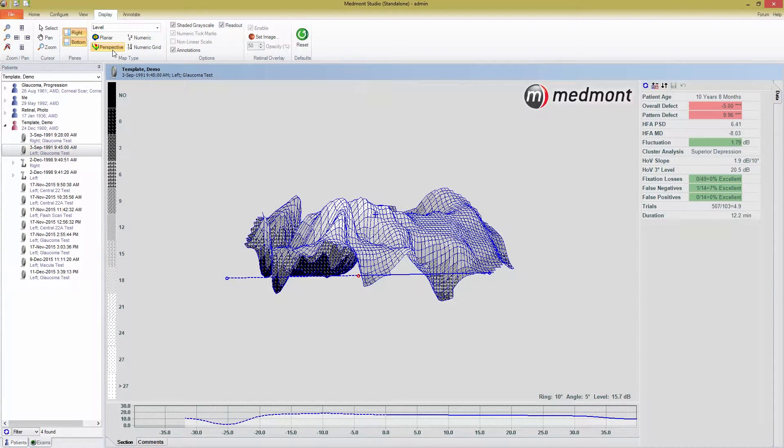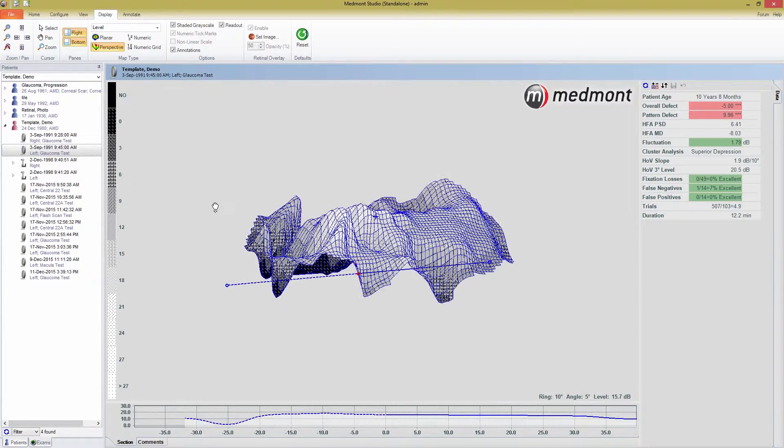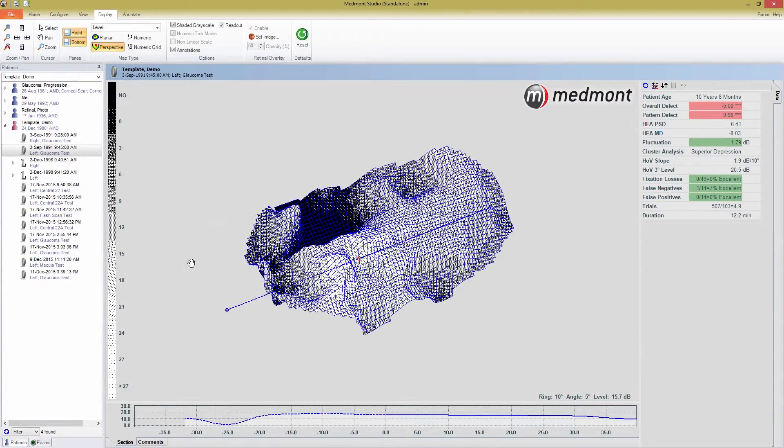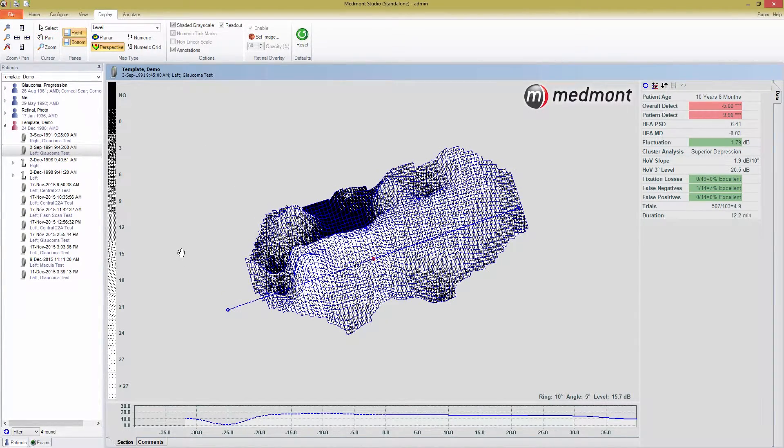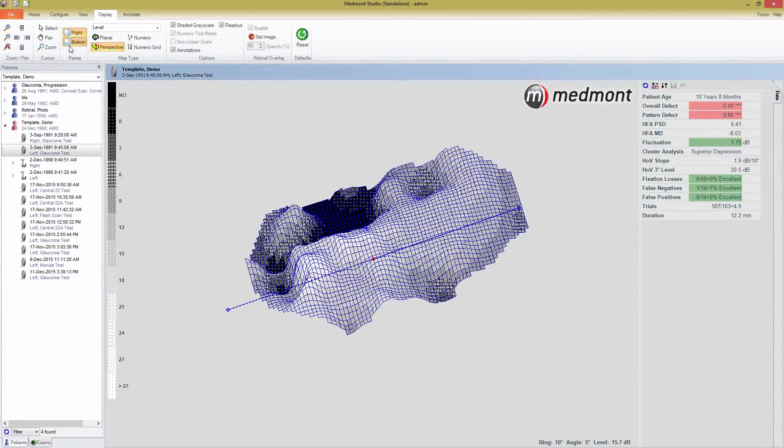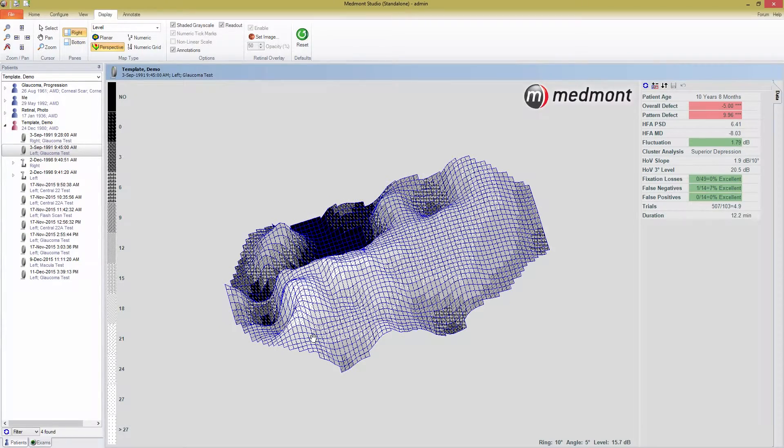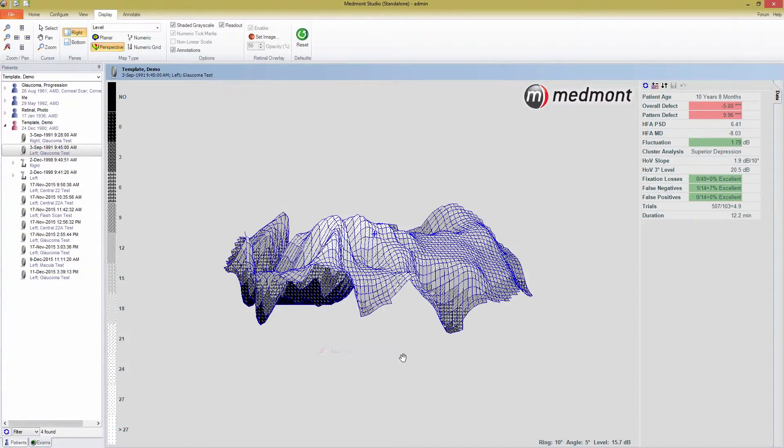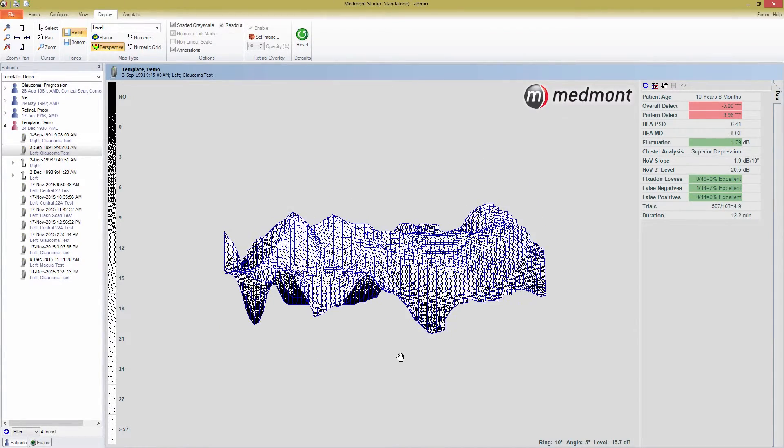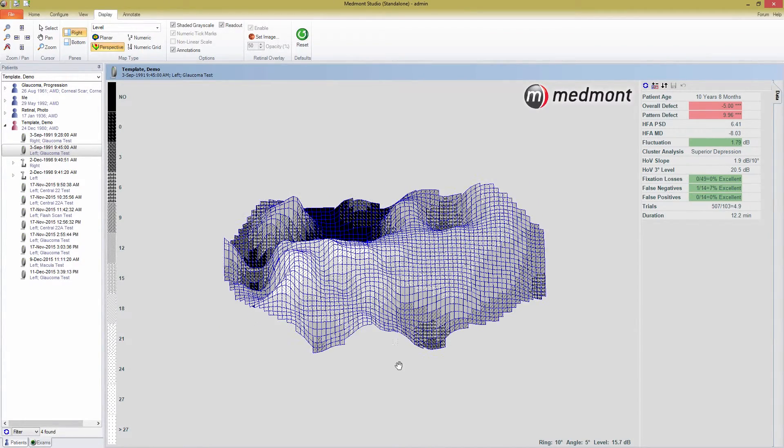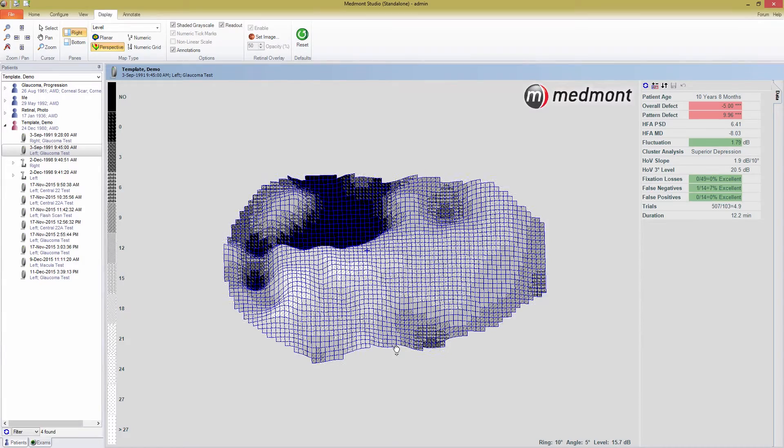Again, your options for this view are color or shaded grayscale. The perspective view can be challenging to use, but patients may enjoy seeing their field in a three-dimensional view. For a more conventional way of viewing field data, the numeric and numeric grid maps are the most important.